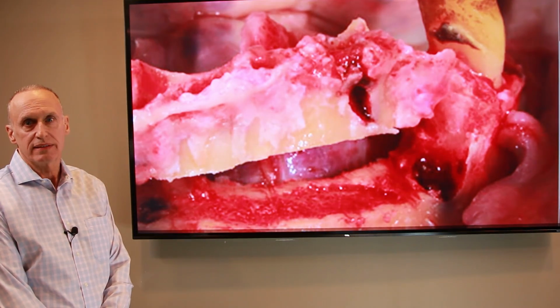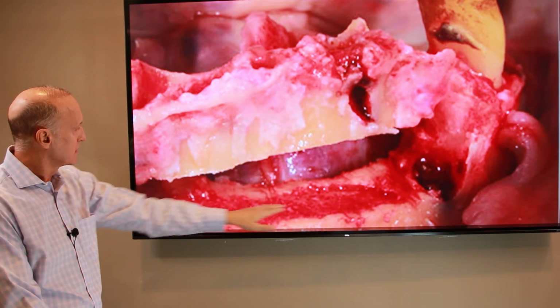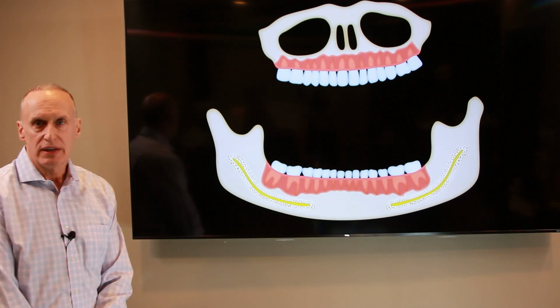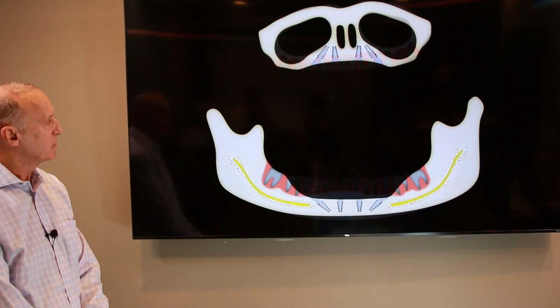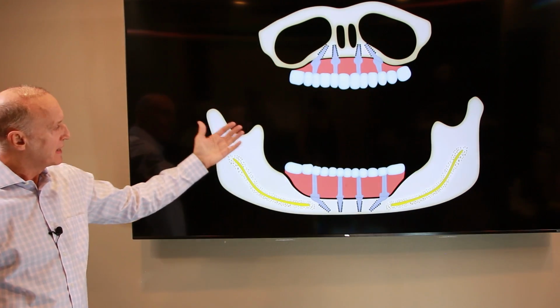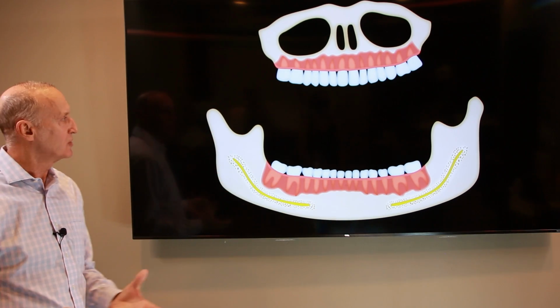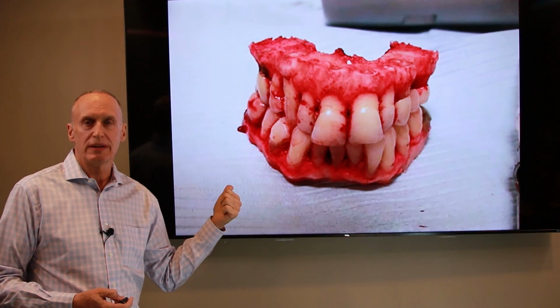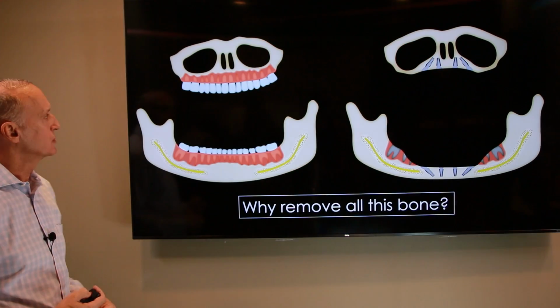And this is what it looks like. This came from an All-On-4 lecture. Reciprocating saw, cutting the bone out. If that doesn't make sense to you, I made this video as part of another YouTube segment that we show. So they take a person that may have 100% of their bone and they take them down to that last person, the bottom example on that model that I showed you. So there's even doctors out there who on social media brag about how fast they can do it. I'll let you draw your own conclusions.